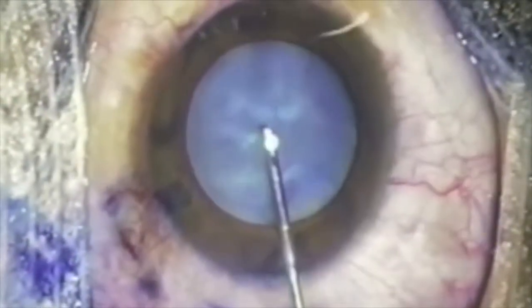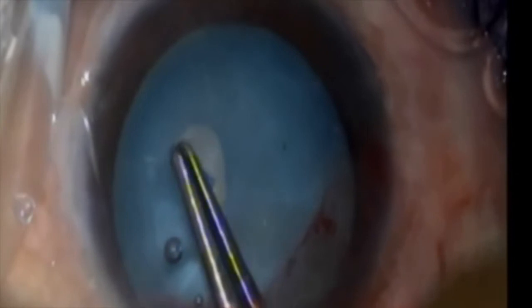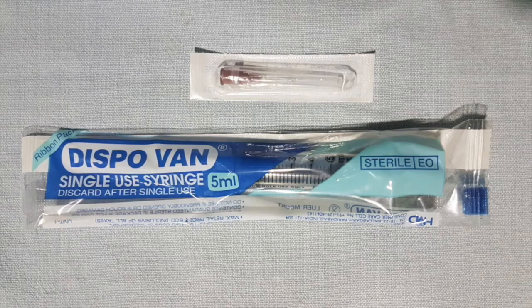The challenge to all ophthalmologists is to get a complete continuous curvilinear capsular rhexis in a case of mature intumescent cataract. Due to raised intralenticular pressure, chances of rhexis runaway extension and Argentinian flag signs are always in the back of our mind. This video depicts a novel yet simple technique for handling mature intumescent cataract.